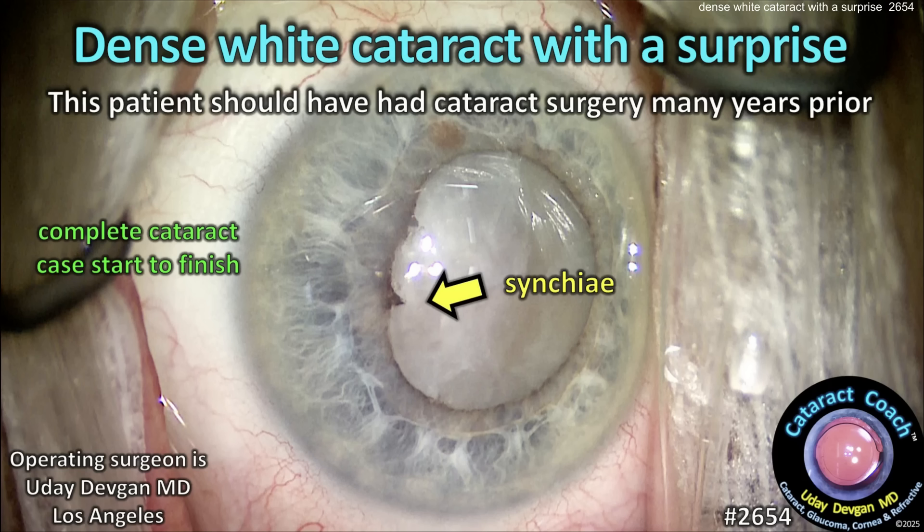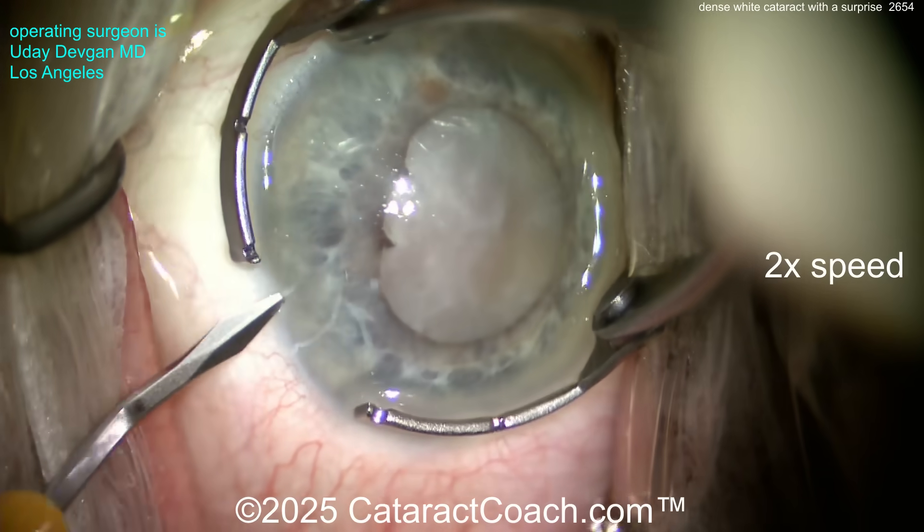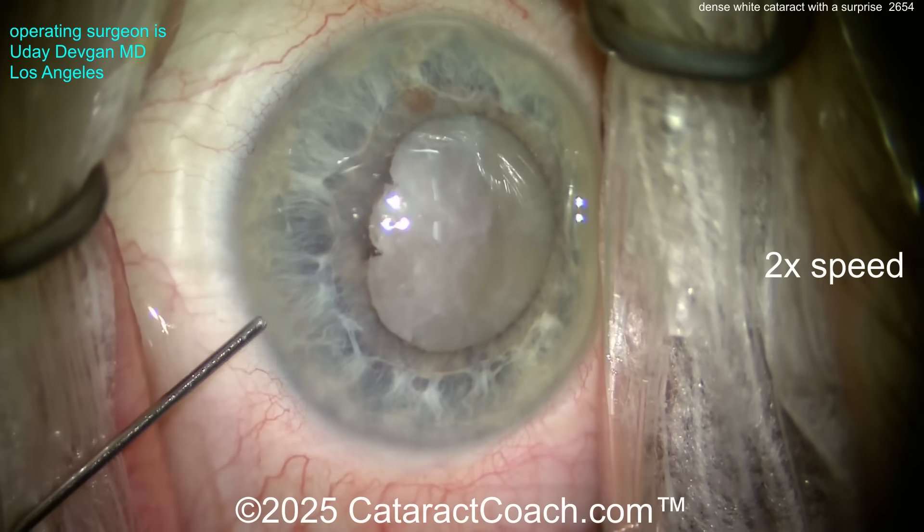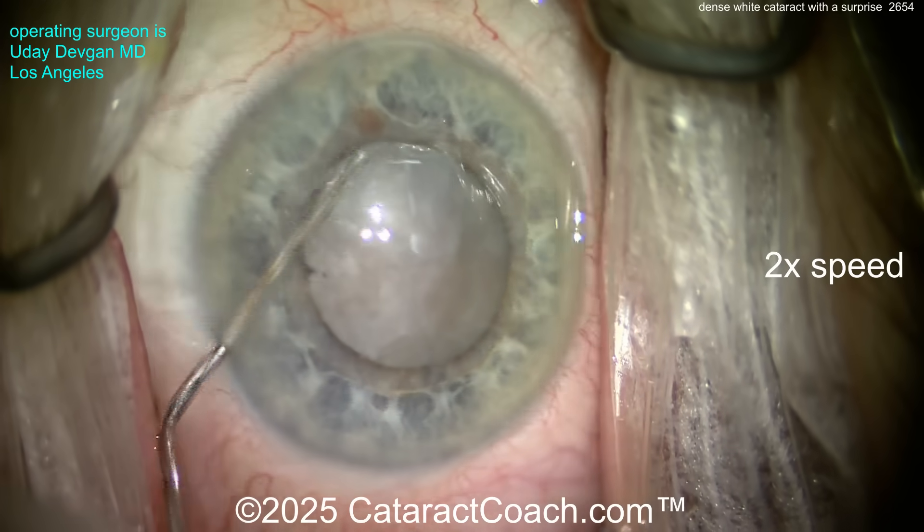cataractcoach.com — a dense white cataract with a surprise. This patient should have had cataract surgery many years prior. It's a complete cataract case operated by me, shown start to finish at 2x speed. You can see the dense white cataract, and there's some synechiae on the eye which you can break pretty easily.